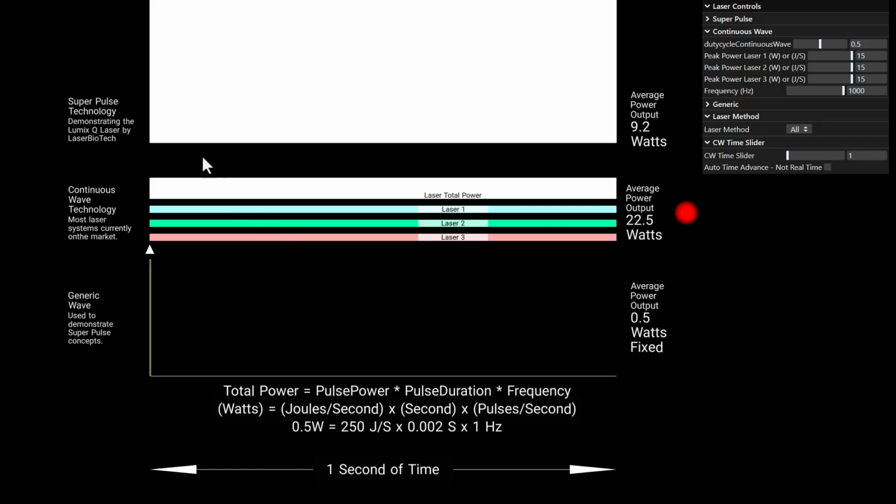a stepping stone to cover superpulse technology, which gets a lot greater depth with a lot less average output power, which means you can get deeper without the heat, which is the problem that you have with continuous wave lasers, is they just have more heat to them. And you'll see why. This is very straightforward why this works, but to see the waveforms is very helpful.